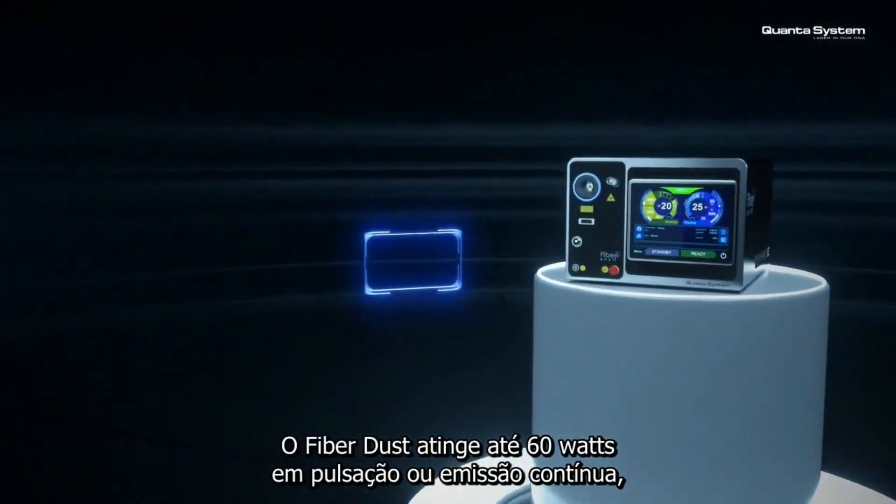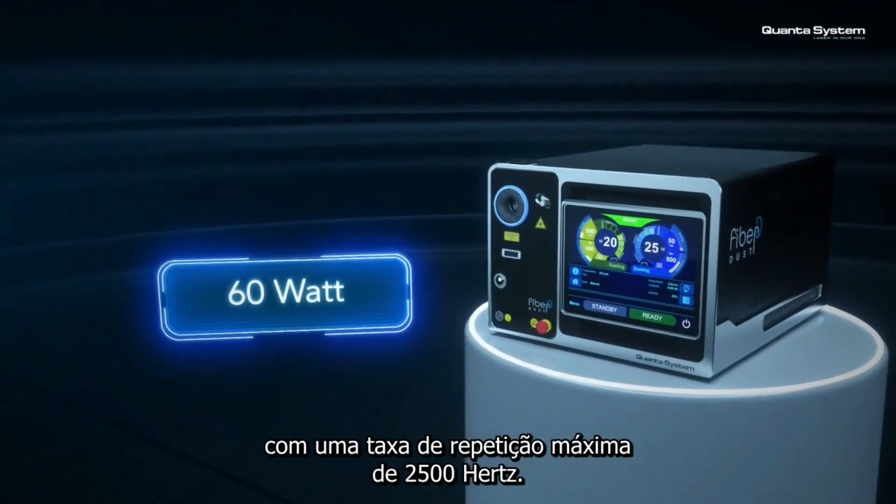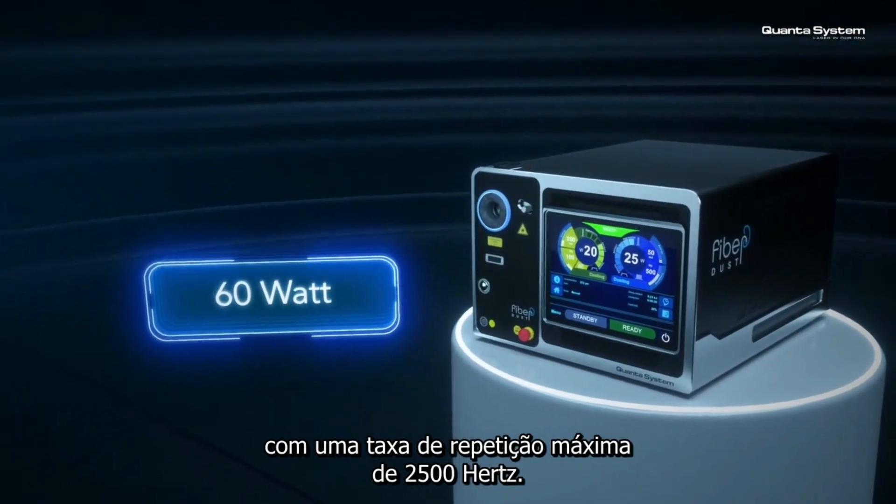Fiber Dust reaches up to 60 watts in pulsed or continuous emission, with a maximum repetition rate of 2500 hertz.